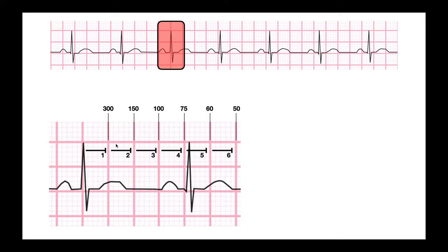I go a second big box over it gets 150. A third big box over it gets 100. A fourth big box over 75. A fifth big box over 60. A sixth big box over 50. Some people memorize those numbers 300, 150, 100, 75, 60, 50. But if you forget those numbers they basically come from this formula 300 over x.